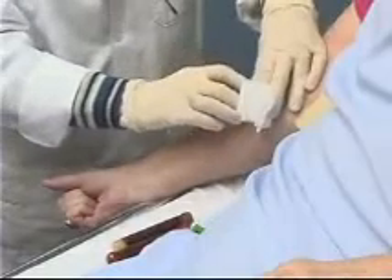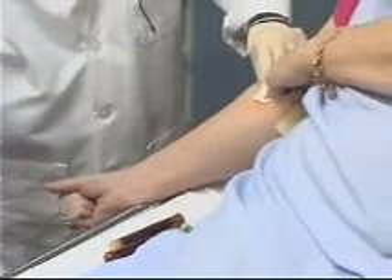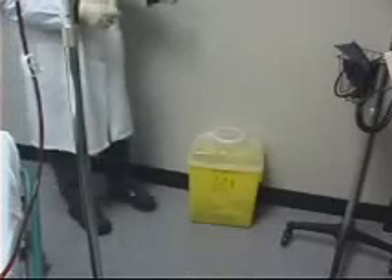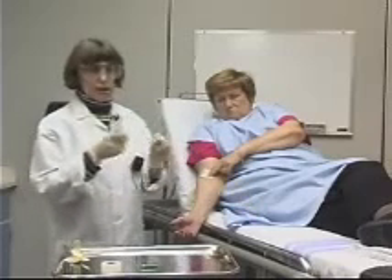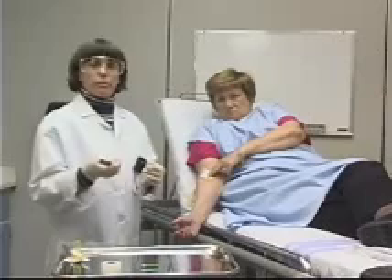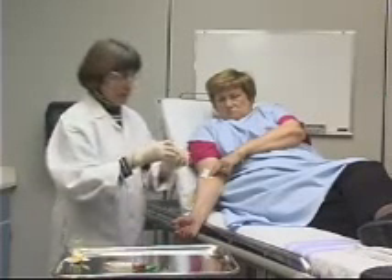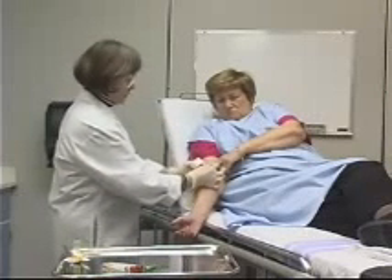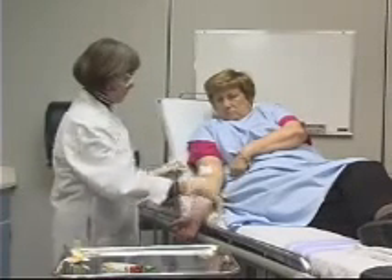I'll take my two-by-two gauze, put it over the site, and very quickly pull the needle from the vein. I can ask my patient to please put some pressure there. I'm now going to dispose of the vacutainer and the needle — without recapping the needle — into the appropriate sharps container. I'll take my blood tubes, label and requisition them, and send them off to the lab. The last step is to come back to my patient and put a piece of tape over the gauze. And we're done.